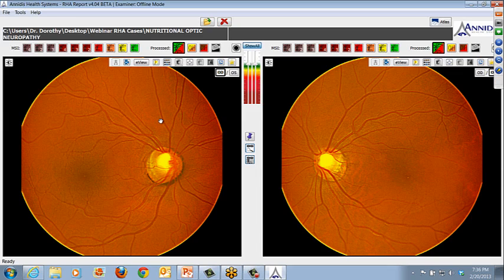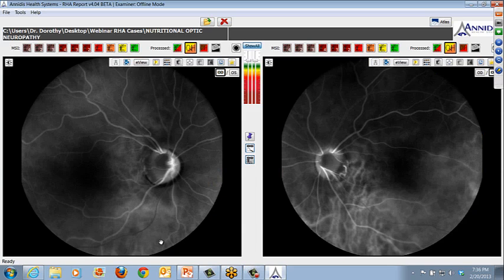And after much discussion with her and her mother, she had suffered for many, many years from severe anorexia nervosa. I did a visual field, but this is what her nerves look like on the oxy-deoxy map. So clearly she has some optic atrophy here. And this is a typical appearance you would get from someone who has chronic nutritional deficits.